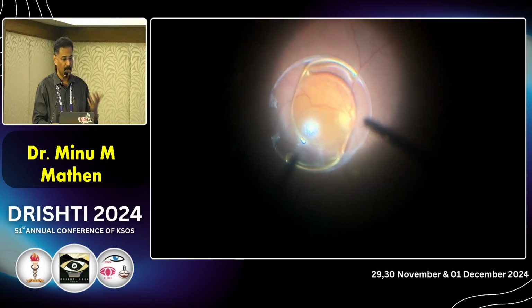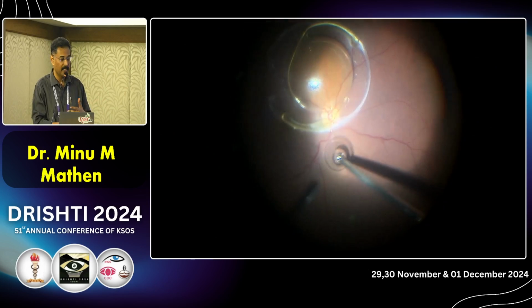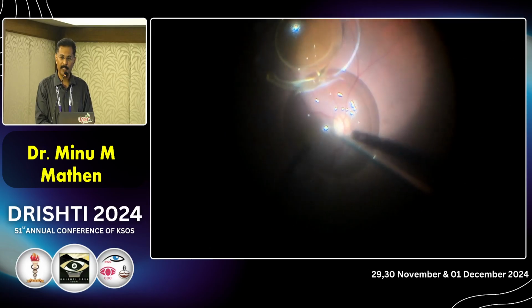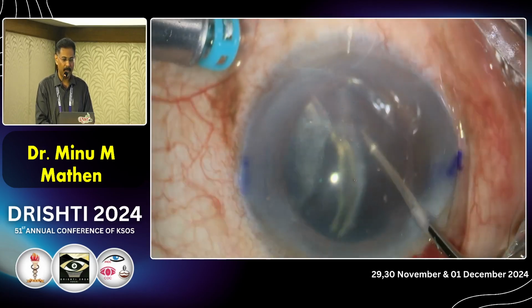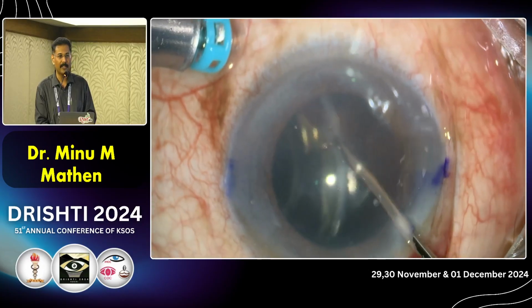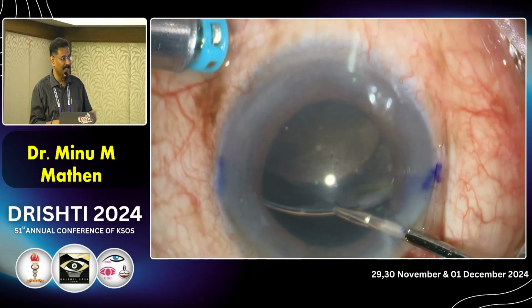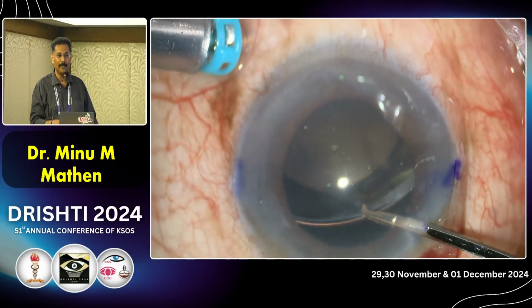So because of pseudoexfoliation, I have been given the topic of pseudoexfoliation. This is very commonly we are seeing this one now. CTR was implanted, IOL was placed, for 3-4 years you remain in the same place, patient will come back with this. If you transfer yourself to some other place, you may escape, but then they will find you and come to your place, and then they will say, I can't see. So these kind of spontaneous subluxations happen.